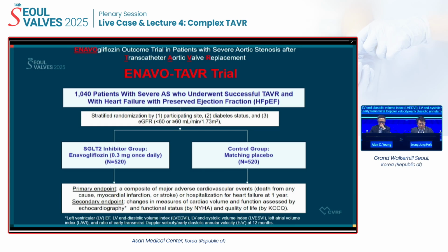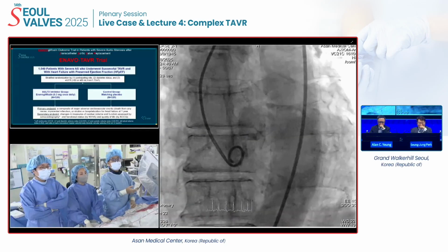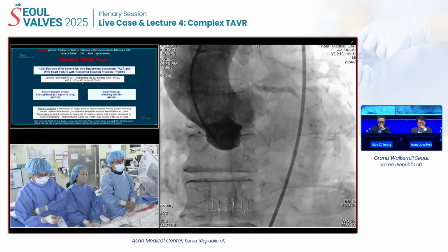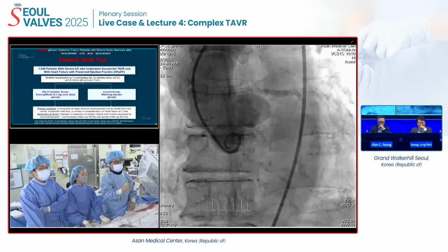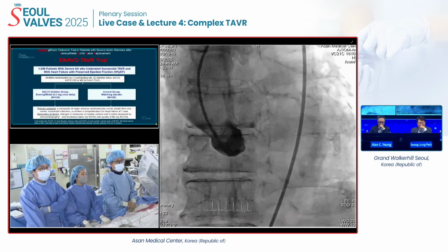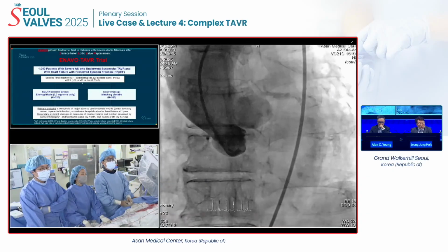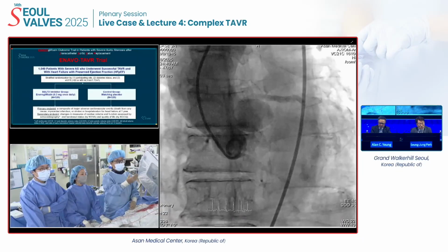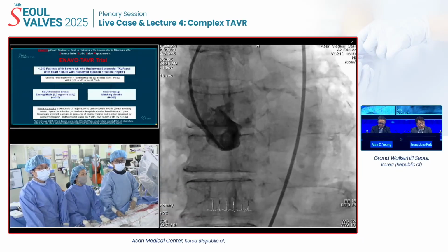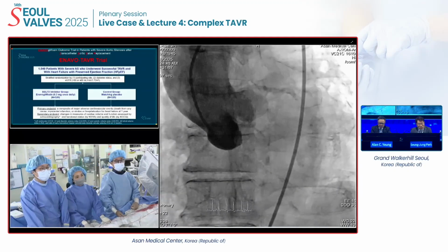Now we have some discussion time. Technically, the combined calcium score was 800. As you see in the aortogram, there was some severe MAC. Also, the septum was very thickened, approximately 18 to 19. The aortic valve is very narrow, with a Vmax of approximately 5. So our first discussion point is severe calcium and a hypertrophic septum, and which valve would be suitable for this patient.